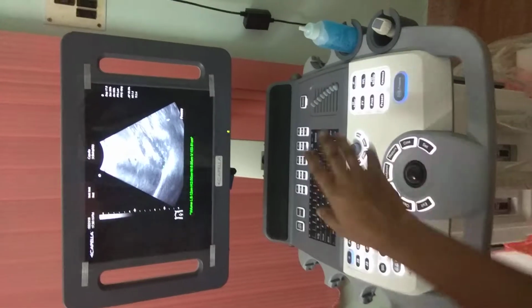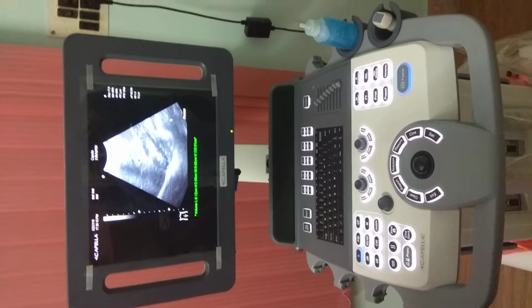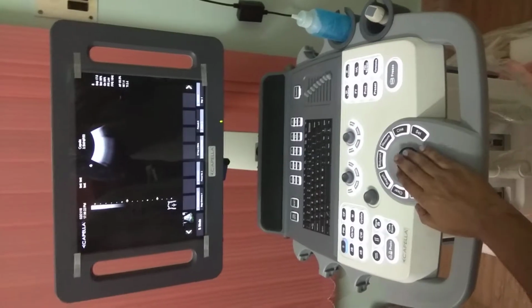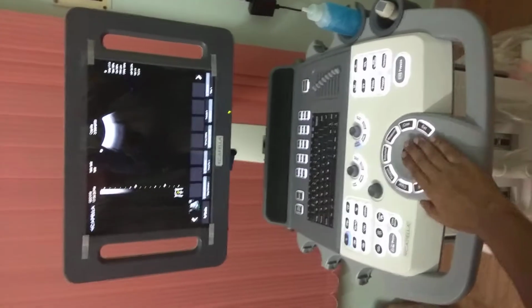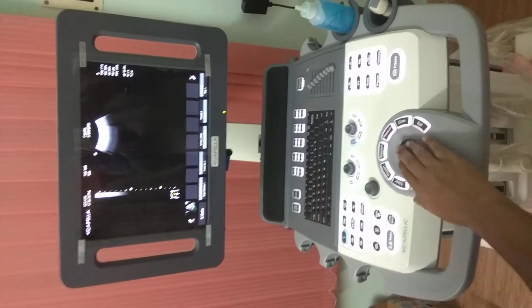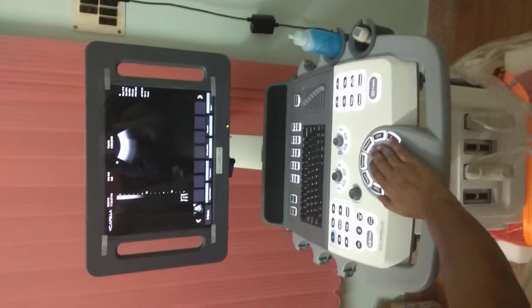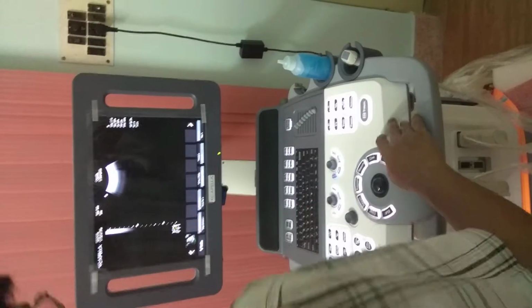So you can see these annotations over here, and if you just press the store button, the image will be stored inside the machine directory, and you can recall these images from this part as well. This is a marker for the probe. So this is how the machine operates.